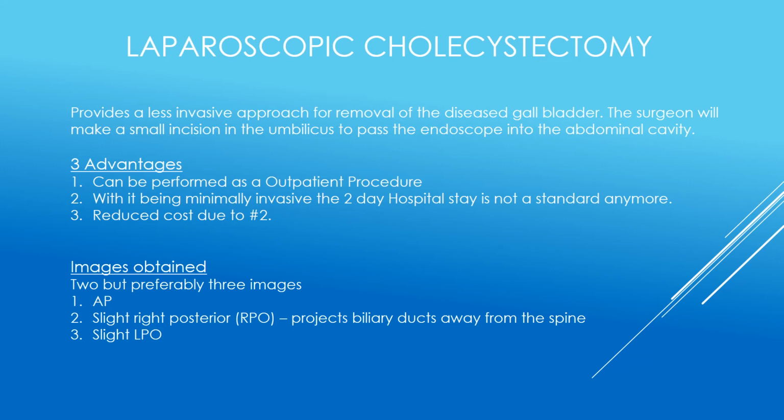Images obtained: two, but preferably three images. An AP, a slight posterior RPO, which projects the biliary ducts away from the spine, and a slight LPO.